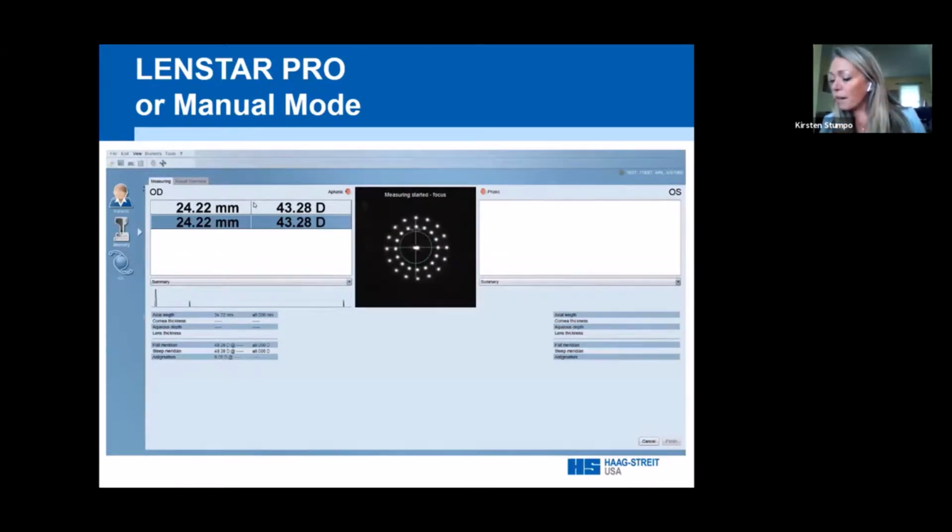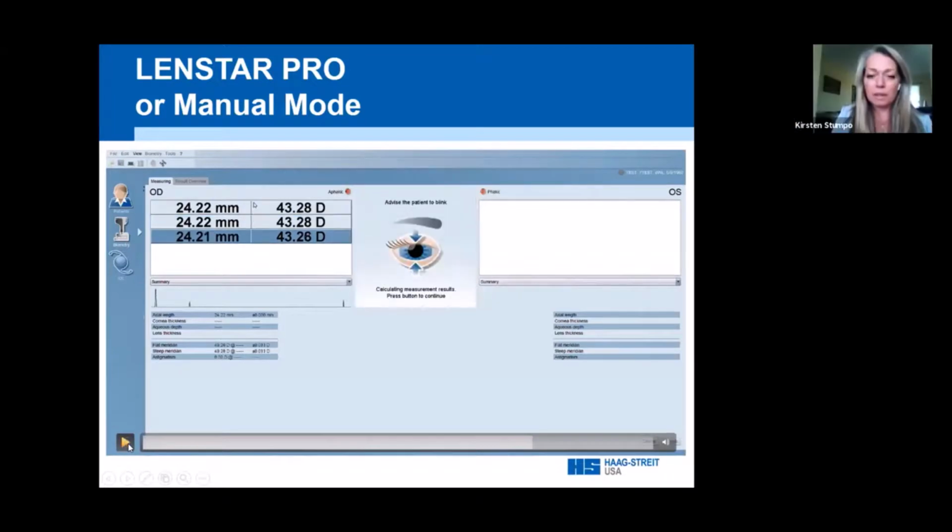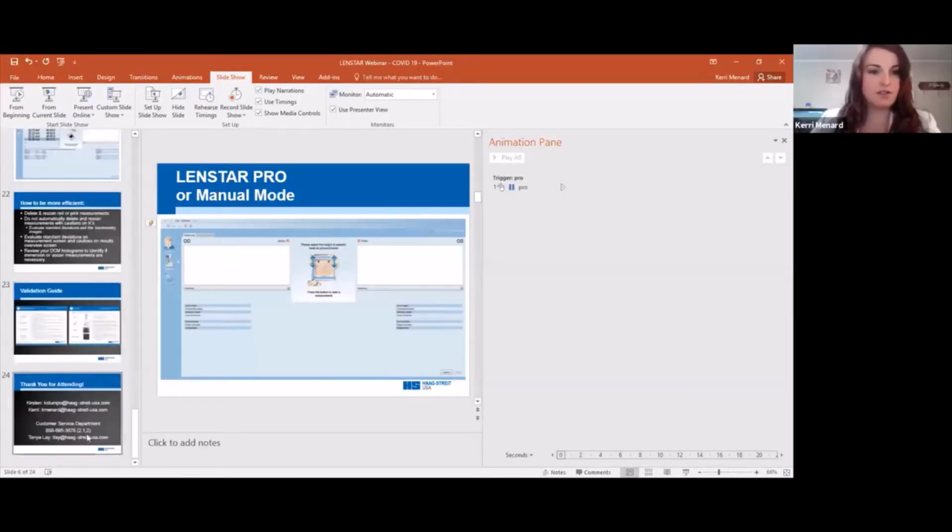Also, you want to go over, Carrie, a little bit about the iris barycenter and the pupil barycenter? Sure. So, probably be best if I show my iSuite software.